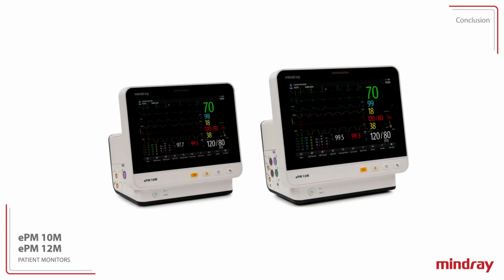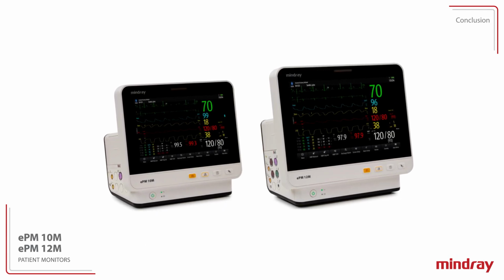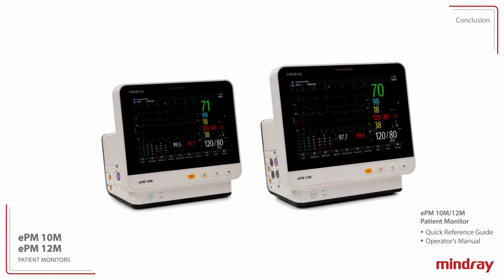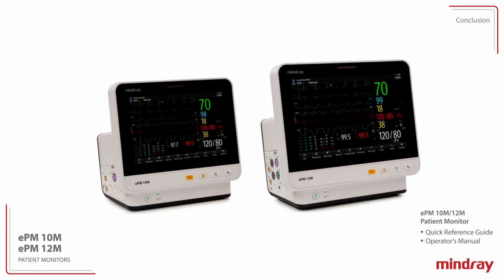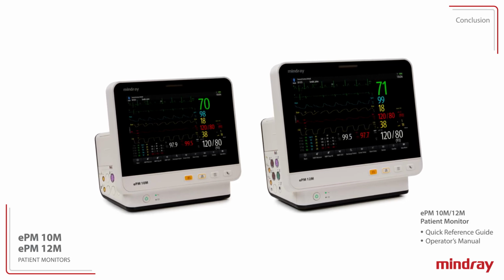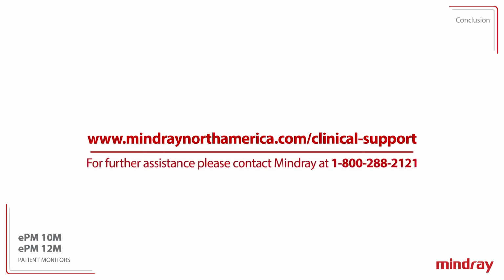This concludes the overview of the Mindray ePM 10M and 12M patient monitors. Please refer to the ePM 10M and 12M Patient Monitor Quick Reference Guide and Operator's Manual for more information. Visit our website for additional clinical documents and further assistance, or contact Mindray by phone at 1-800-288-2121.